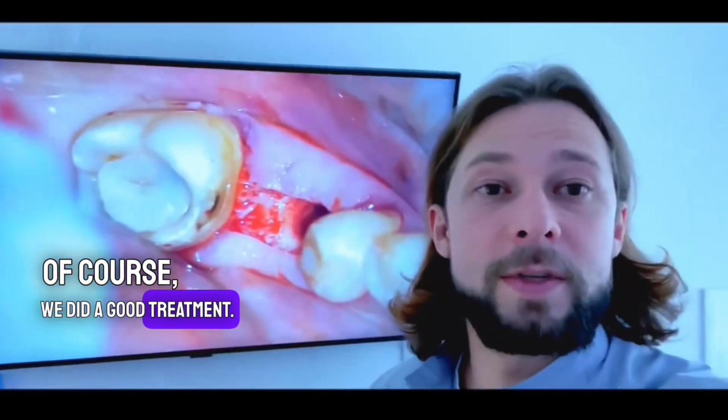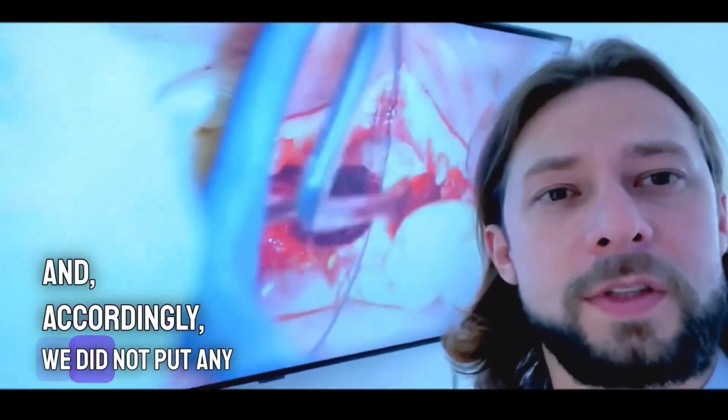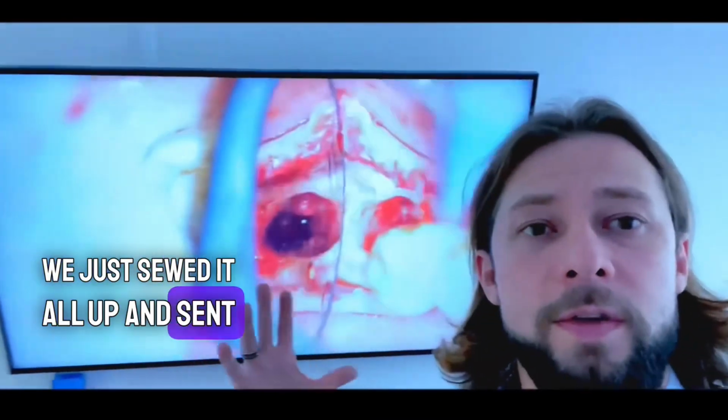Of course, we did a good treatment. Everything was cleaned very well. And accordingly, we did not put any implants. We just sewed it all up and sent the patient for healing.